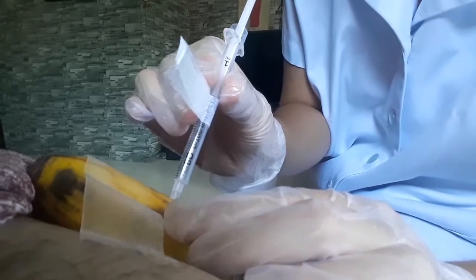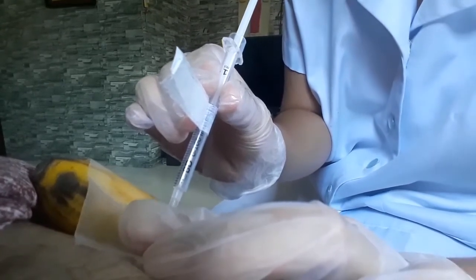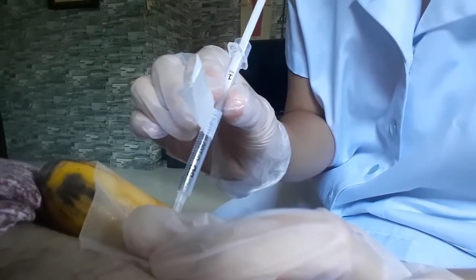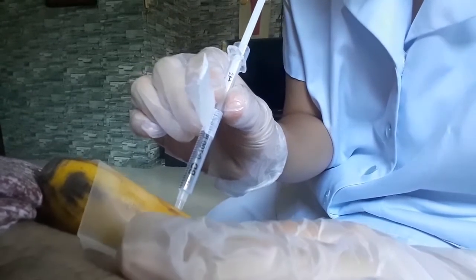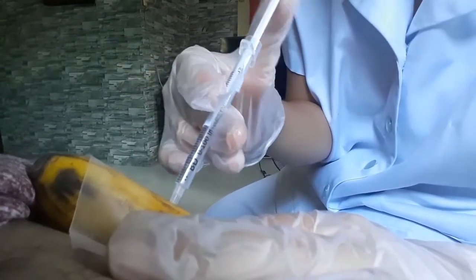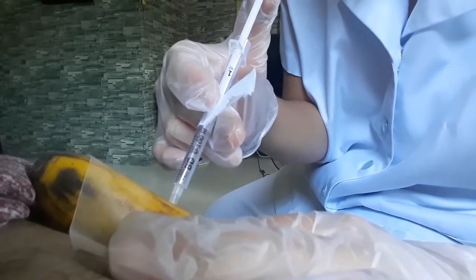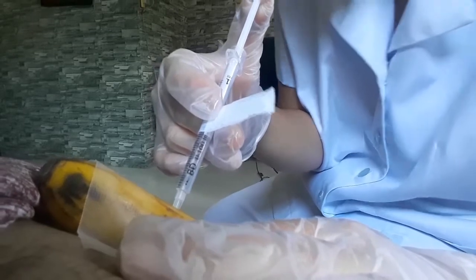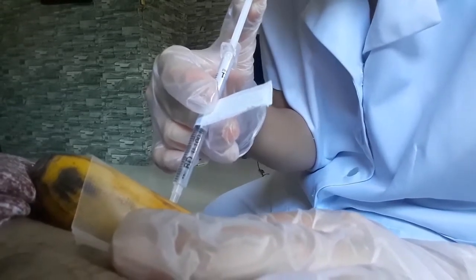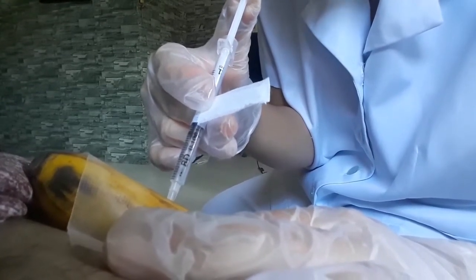And then release the pinch. Then after releasing the pinch, I will place my non-dominant hand at the patient and move my dominant hand to the edge of the plunger and slowly release the medication to the client over several seconds.